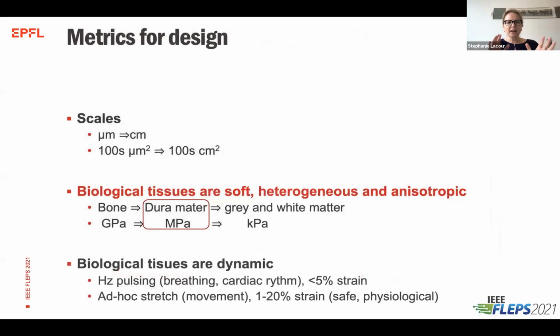And so if I look at what we just discussed, you really need to analyze where you want to position your soft device to understand at which scale you want to interface. So do you want to aim for single neuron activity, so reaching the micron scale type of devices, or are you happy with a larger interface which will then allow you to collect local field potentials, so more compound information from the brain? So it is your application that will pretty much orient your overall design.